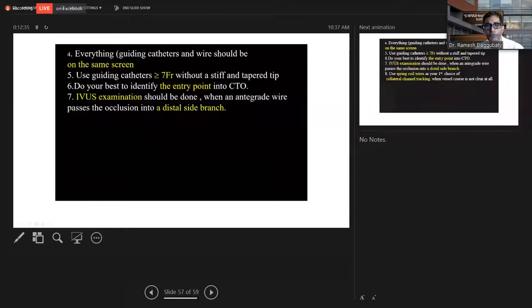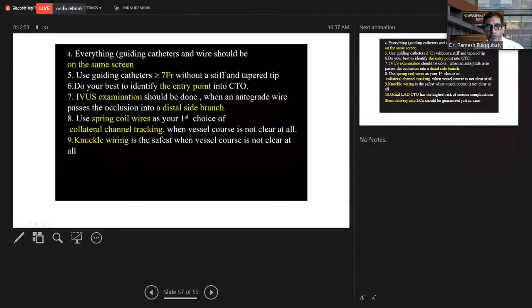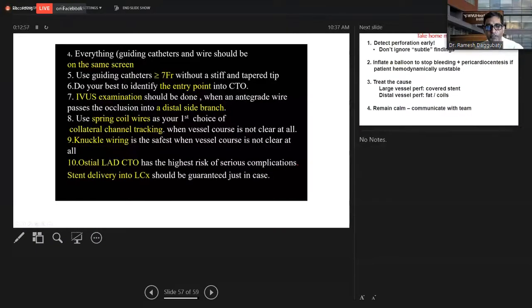IVUS examination should be done when an antegrade wire passes through the occlusion into a distal side branch. It is very helpful to know where you are. Use the spring coil wires as your first choice of collateral channel tracking, and when vessel course is not clear at all, knuckle wiring is the safest. And I'm sure Dr. Kalyan Sundaram might have shown you some of these cases as well.